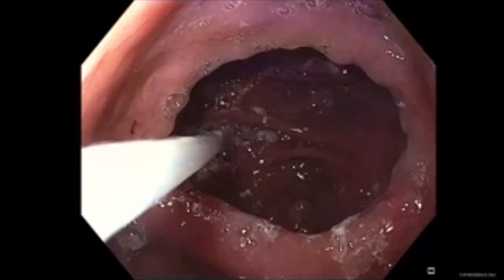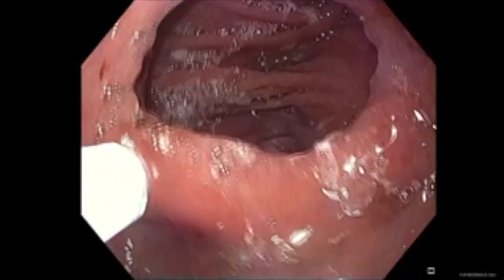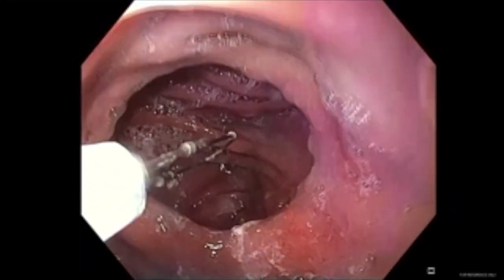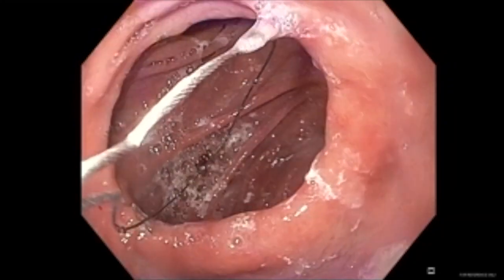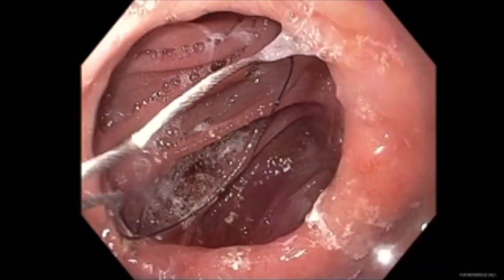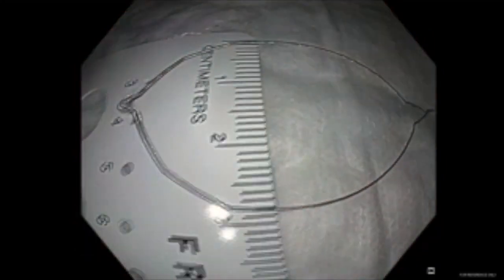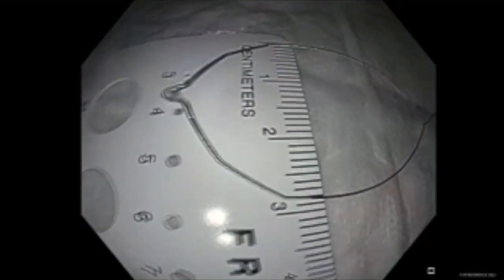Attention may then be turned to measuring the gastrojejunal aperture, which may be estimated in comparison to the distal end of the scope, or more precisely measured with a 3 cm snare. The snare is opened until it touches the opposite walls of the anastomosis, is then externalized and measured. Our patient's stoma is approximately 28 to 30 millimeters based on this measurement technique, and she will be scheduled for an outlet reduction procedure with endoscopic suturing.